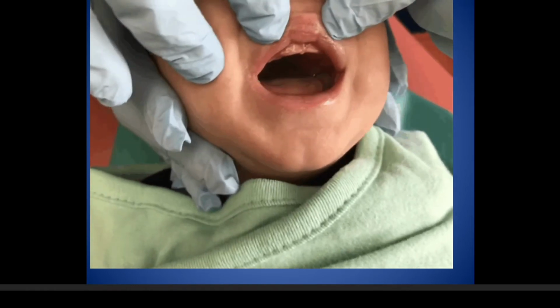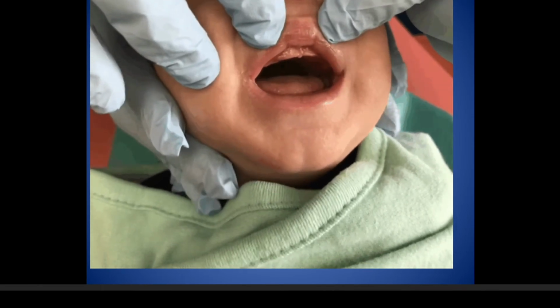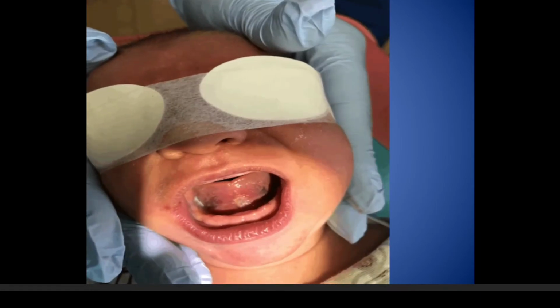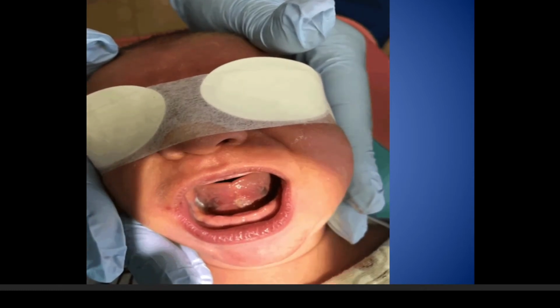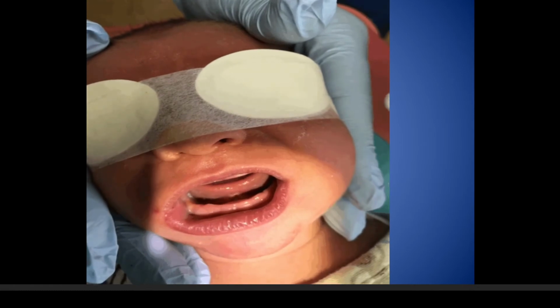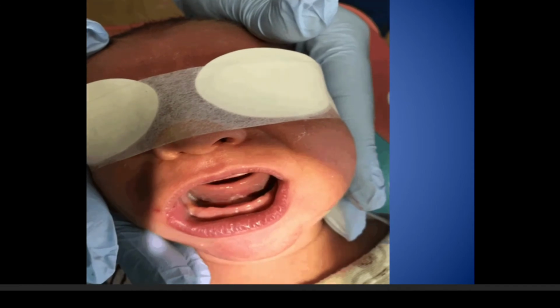How do we get from here? Notice no peristalsis of the tongue, no extension of the tongue out of the mouth, no elevation of the tongue to the roof of the mouth, no lateralization of the tongue. So how do we get from here to here? Beautiful elevation of the tongue to the roof of the mouth. The baby can now grasp onto mommy's nipple and nurse successfully, and you see the immediate post-op little scar on the base of the tongue from the tongue tie release. No bleeding, no swelling, beautiful result.